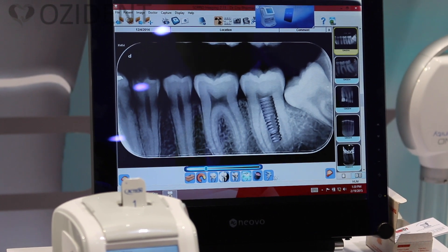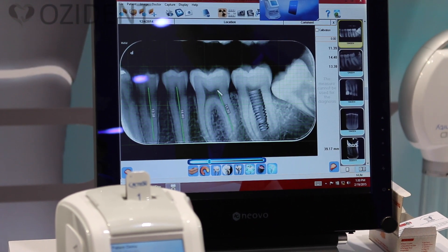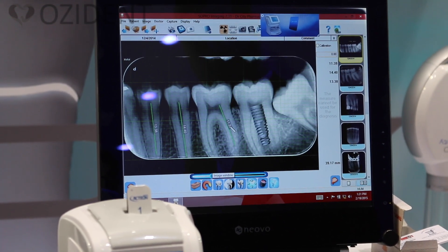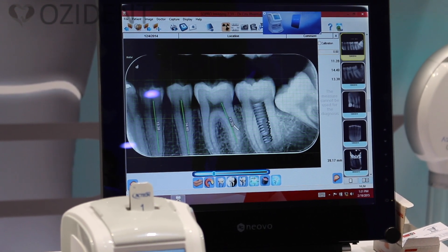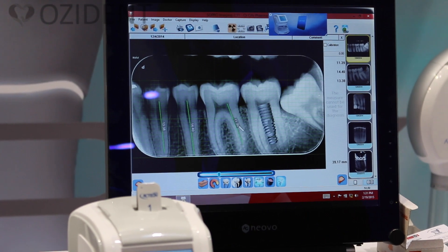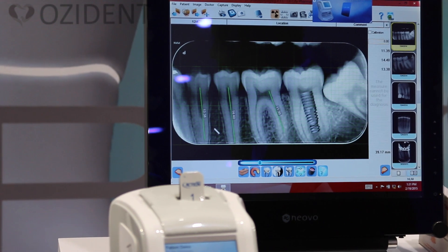You have lots of options here. If you want to do a measurement for a root canal, you can measure it in millimeters to however many decimals you want. For example, I have it set to two decimals — so 11.39 millimeters. You can have the exact measurements.